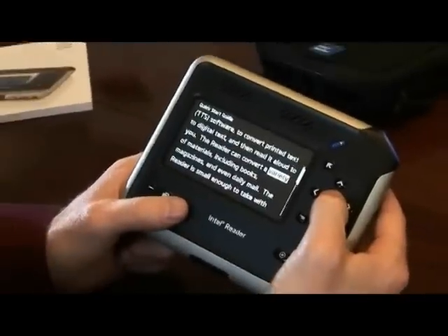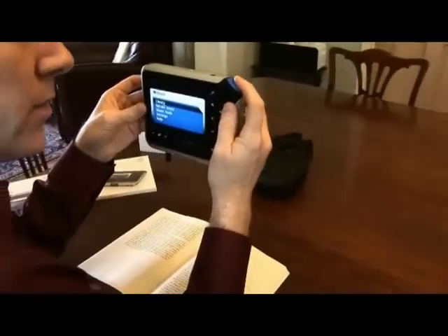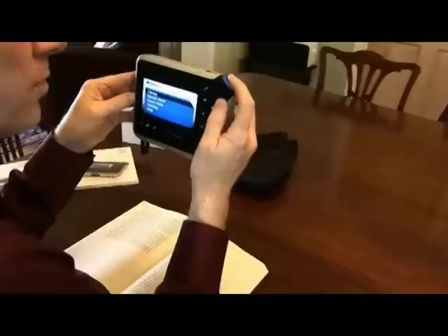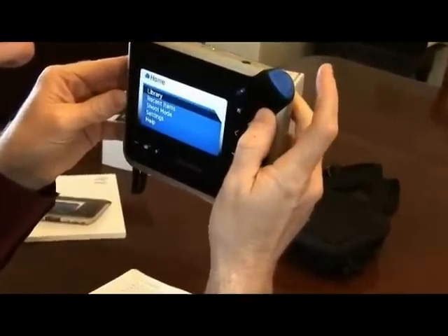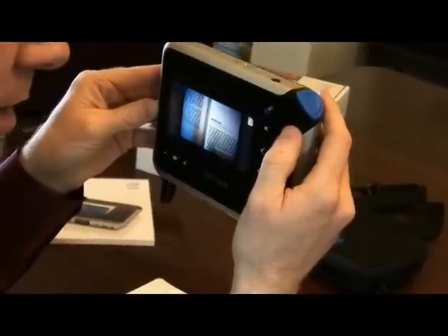So now that we've got the basics down on how to use it, let's do some shooting and capture some content that we want to read. I'm going to open to a random page and thumb through it at random until we hit something that looks fun. Let's read this page — I opened up on chapter 30. I'm going to pick up my Intel Reader and enter it into shoot mode. I do that by pushing the large blue button up here or by going down to the shoot menu and selecting. So I'll push it once. Now we're in shoot mode. The camera turns on and immediately begins adjusting to the light in the room.